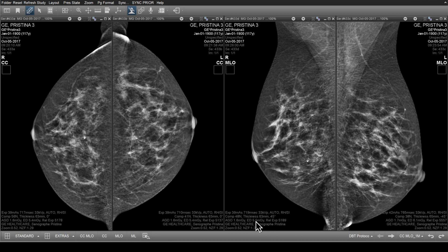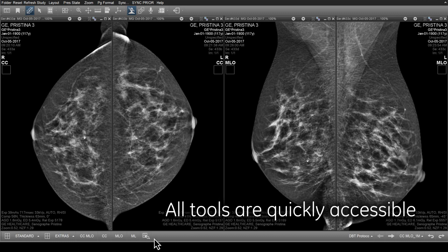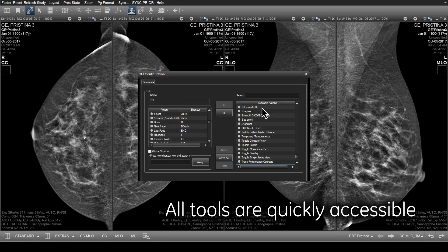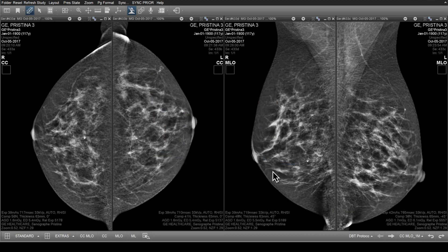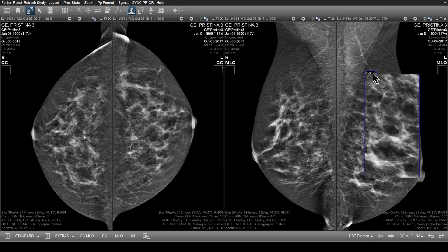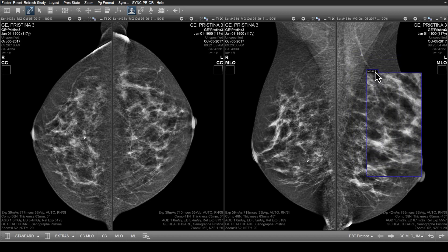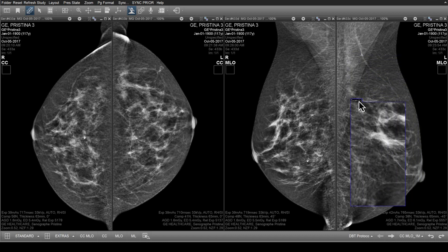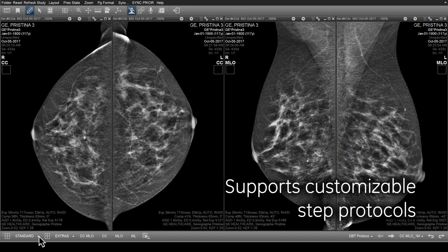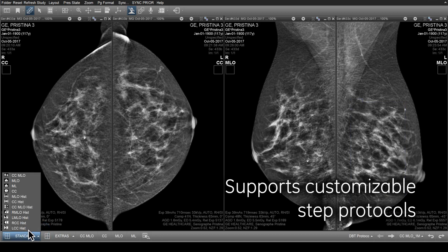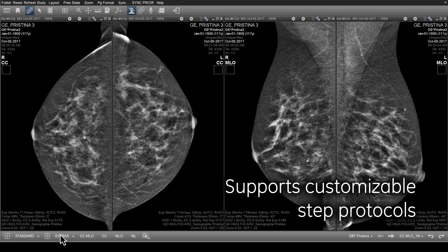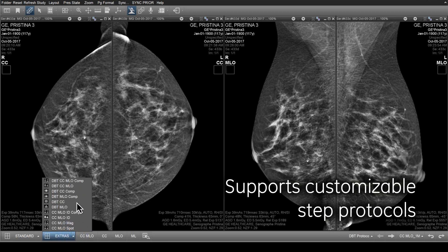A mammography-specific toolbar puts all relevant tools in one easily accessible location, and users can fully customize mouse and keyboard shortcuts for reading efficiency. All of Universal Viewer's diagnostic imaging tools are available, such as zooming the images or annotating the region of interest of a specific finding. Users can create, apply, and share custom step protocols — a sequence of layouts used to review mammography images in sequence.